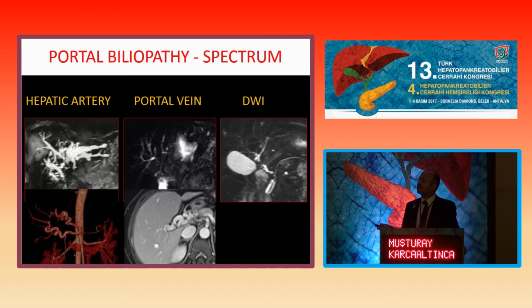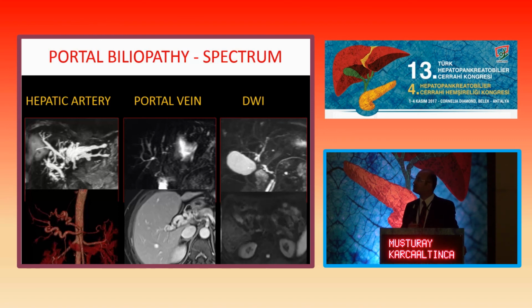So in this patient, the obstruction was at two different levels because this time it was caused by the dilated hepatic artery. And in this patient, it's at the level of hilum. You can see these blood vessels, and sometimes really it can mimic a mass because they're so vascular and look like a mass, but you have to be careful if the patient has a chronic portal vein thrombosis history. And you can see the compression at different points, and these are usually due to these blood vessels.